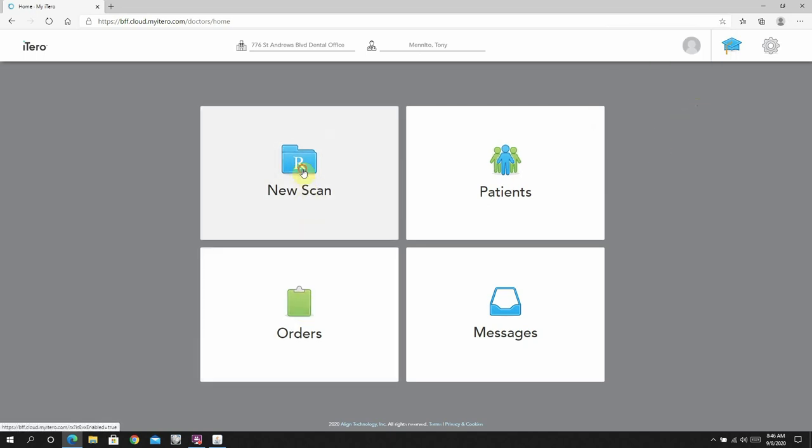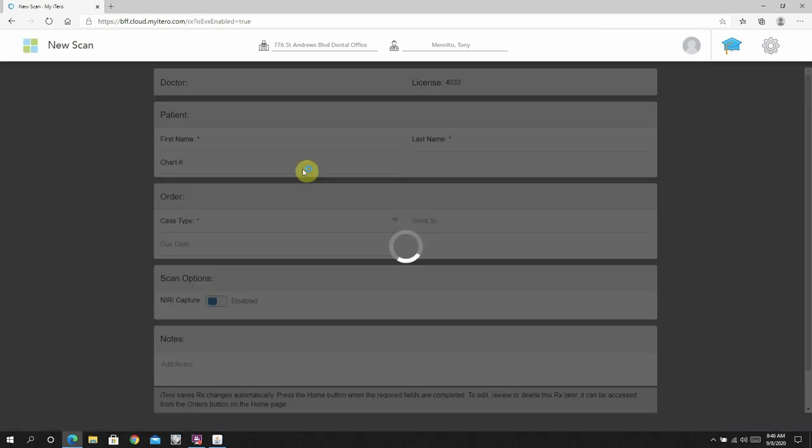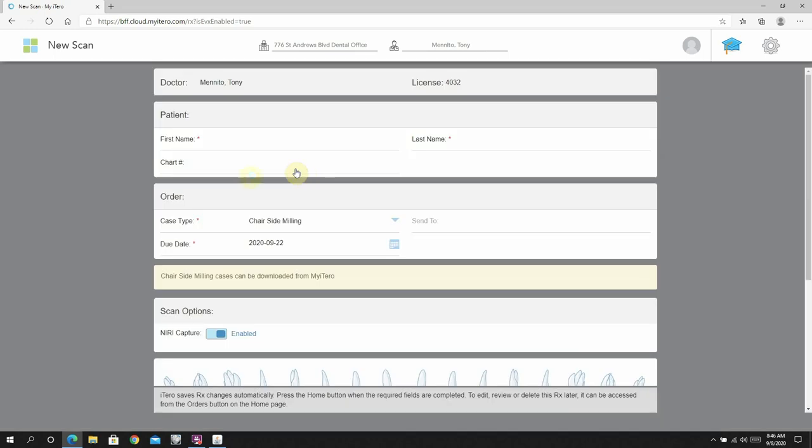So let's get started with this workflow. Basically, the really important thing when you're setting up a case in the iTero is to use chairside milling as your case type.